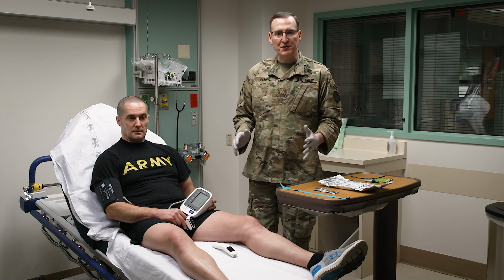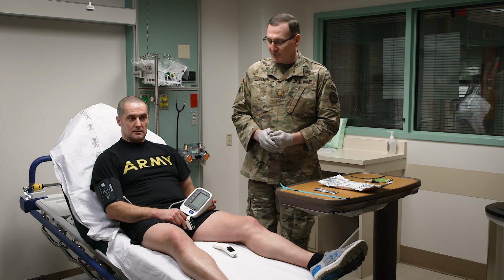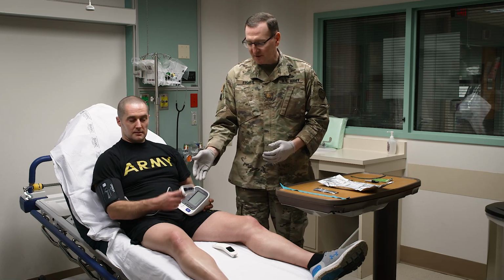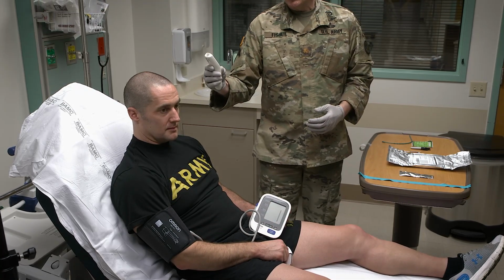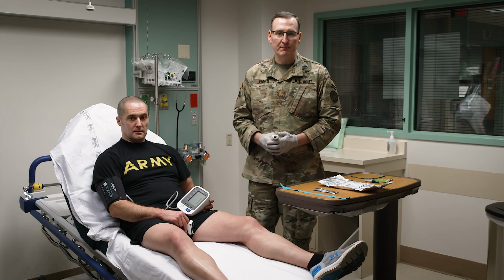Before starting any intervention on any patient, we want to make sure that we take a good set of vital signs. So we're going to make sure we have a blood pressure. We're going to have a pulse oximetry that has both the pulse and the SpO2, and we make sure we take a temperature. Once that is complete, we can go ahead and move forward with our donation process.